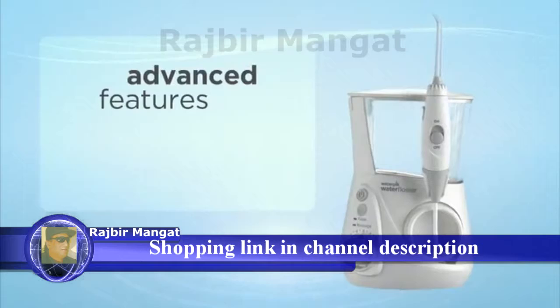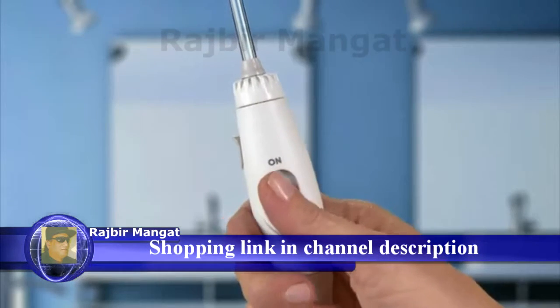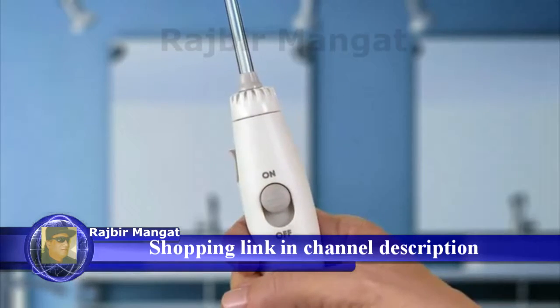With advanced features and a new sleek design, with on-off water control on the handle for greater ease of use and a mess-free experience.